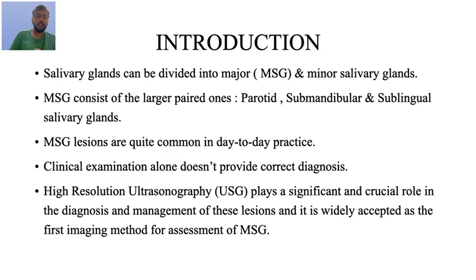Introduction. The salivary glands can be divided into major and minor salivary glands. The major consists of large paired ones like parotid, submandibular, and sublingual salivary glands. The major salivary gland lesions are quite common in day-to-day practice. Clinical examination alone doesn't provide correct diagnosis.